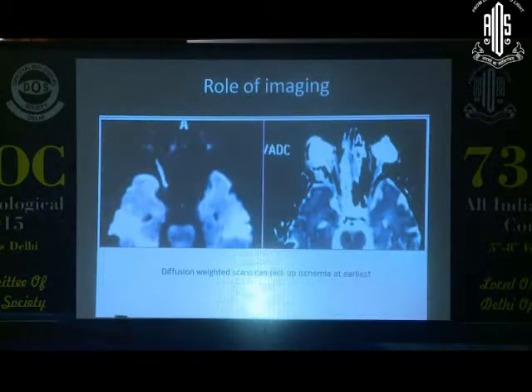As far as the role of imaging, I would request sir to highlight it. Well, the role of imaging until now has not been great. This is one sequence I would just like to highlight called diffusion-weighted imaging. In this particular MR sequence, you pick up the cells with abnormalities which have a restricted diffusion of molecules. Now, for me, this is like a stroke of the optic nerve.